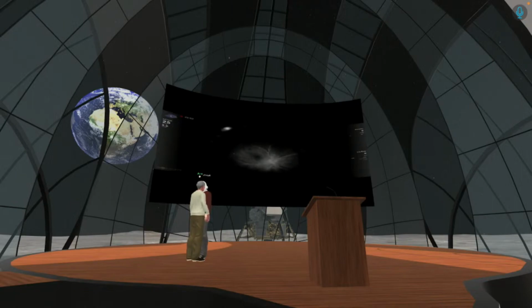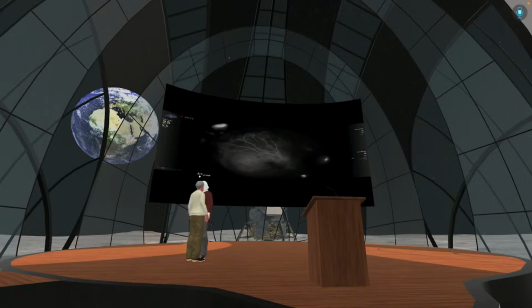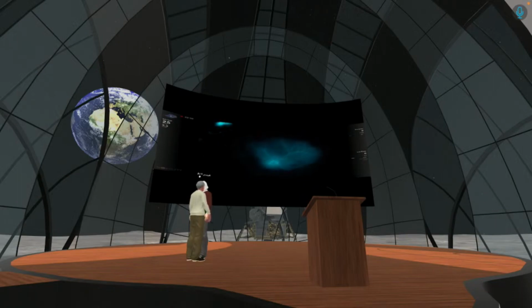This one should be advanced proliferative diabetic retinal disease, and you can see the capillary dropouts and even the absence of, oh no, this is actually a retinal detachment under PFCL, sorry, and this is a 360 degrees retinotomy, and you just might see that changing the color filters can change the detail perceptions.